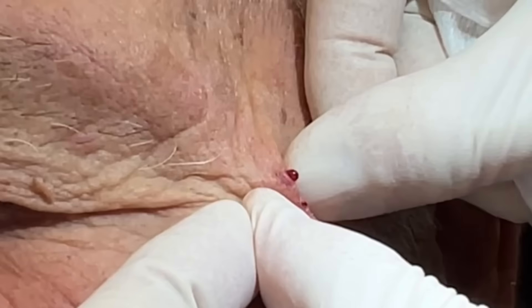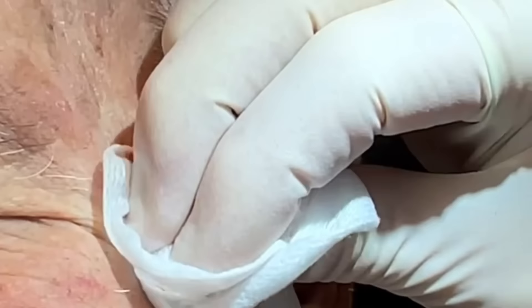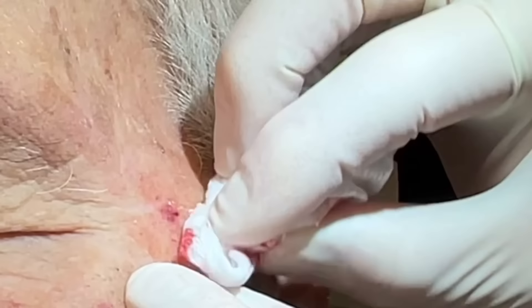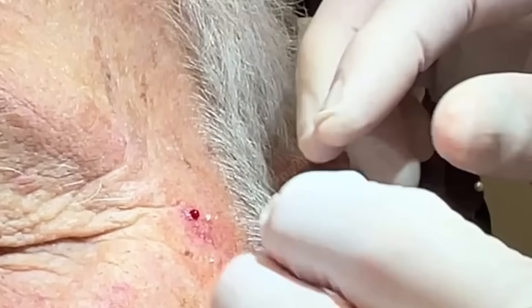That'll make those bumps go away so you don't feel them when you're washing your face. 'Am I not washing good enough?' No, it doesn't have anything to do with that. You just have some solar damage sometimes. You want to give me a little Lido? He's got a vessel I'm going to cauterize here. You do have one vessel that was there — I'm going to give you a little shot to numb you so I can cauterize that, because these can bleed a little bit.